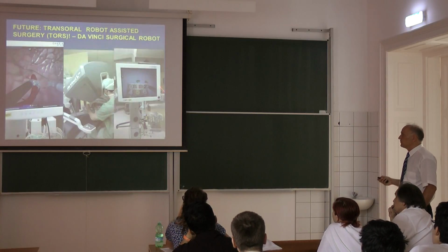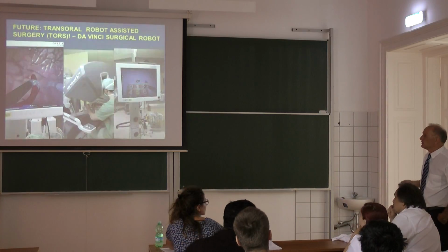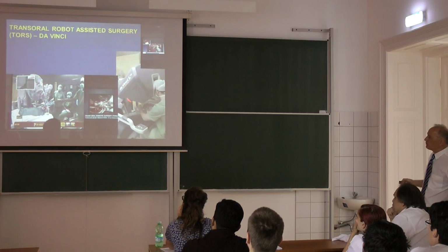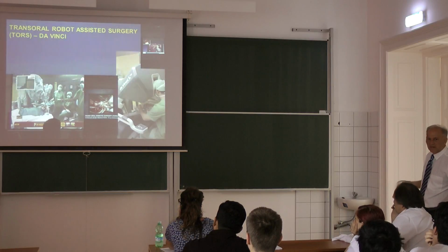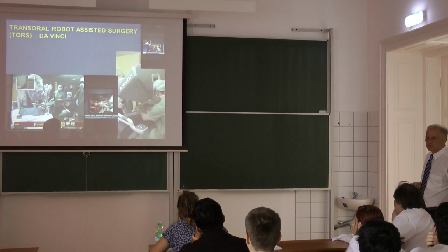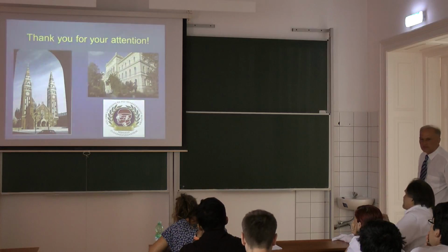And this is a new technique for doing the surgery through the internet as well, if you want. So you see here the setup, and this is the doctor, the expert who can do the surgery with a manipulator through 3D vision, and the setup is somewhere else in the OR. This might be one way of the future of these endoscopic techniques. Thank you for your attention.